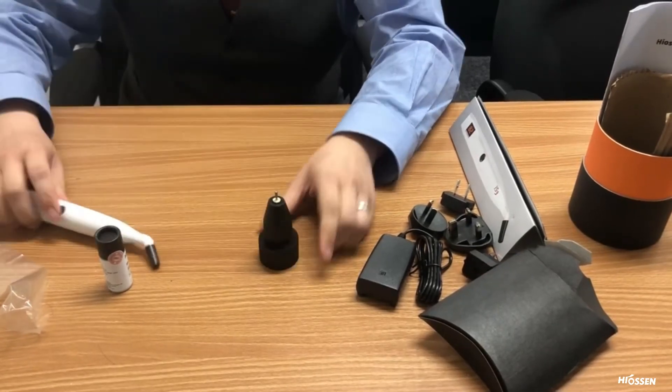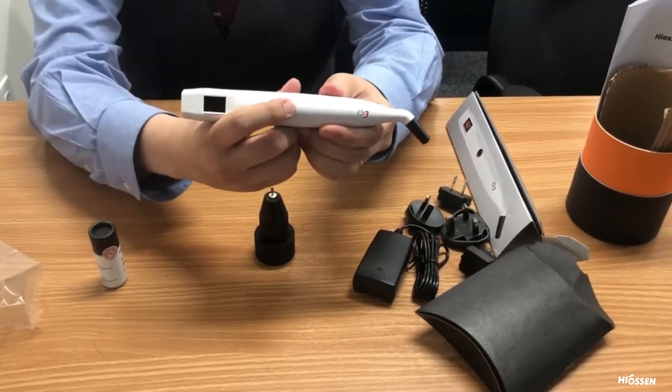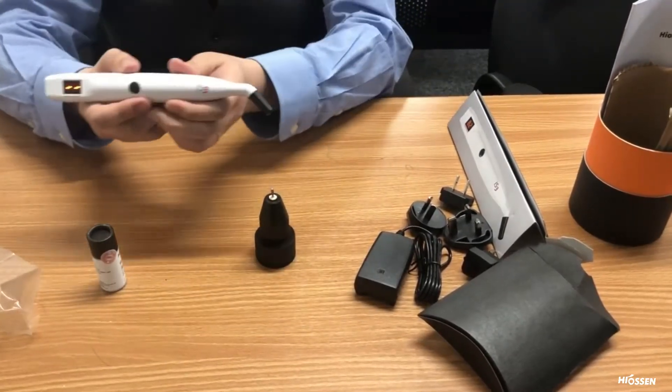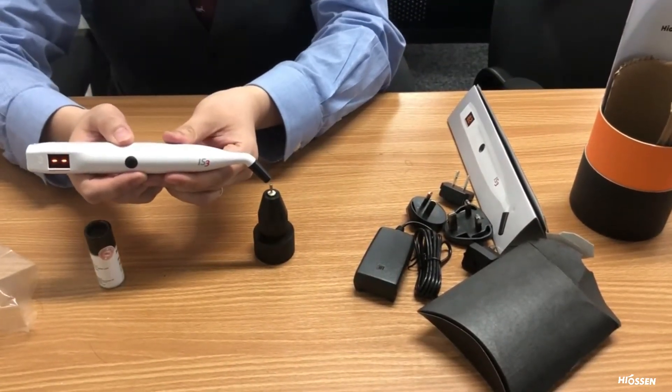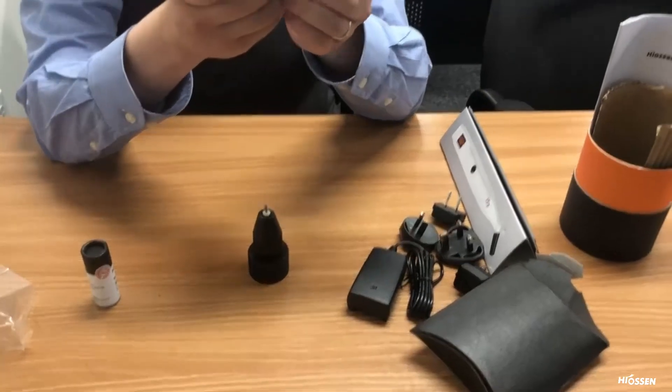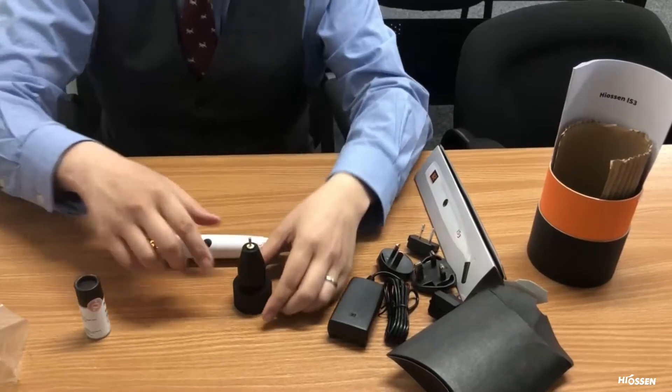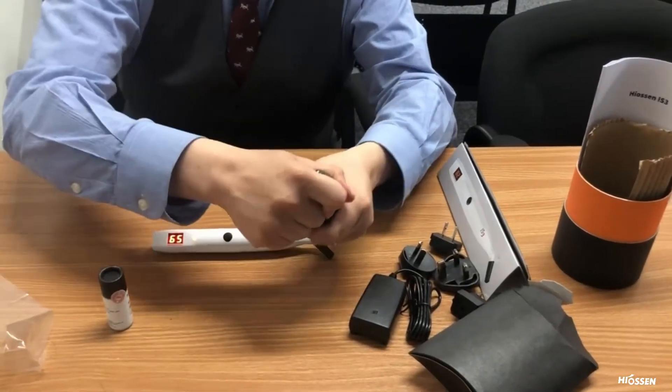I'm going to hit the power button on the IS3 — you can see it's turned on. If I bring it close, I don't have to touch it. We're going to get a reading of 65.